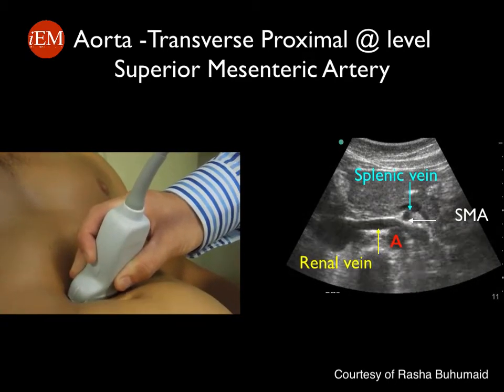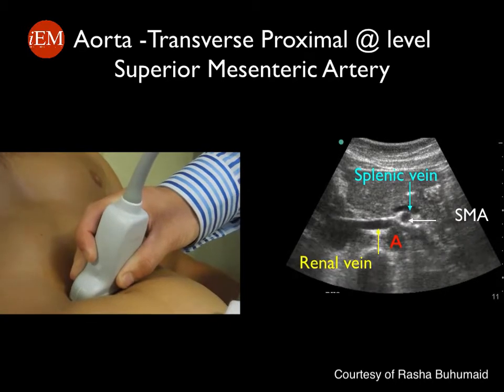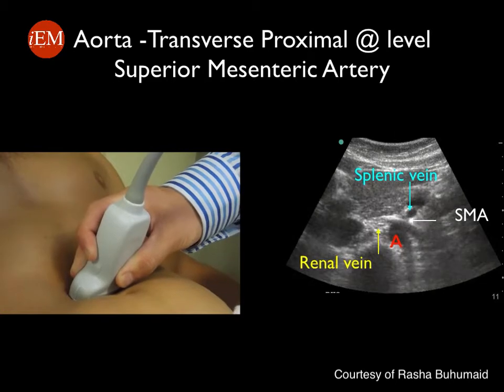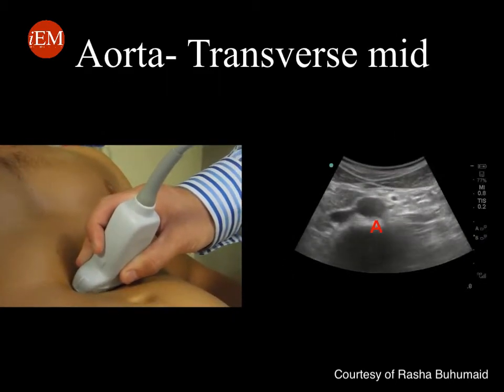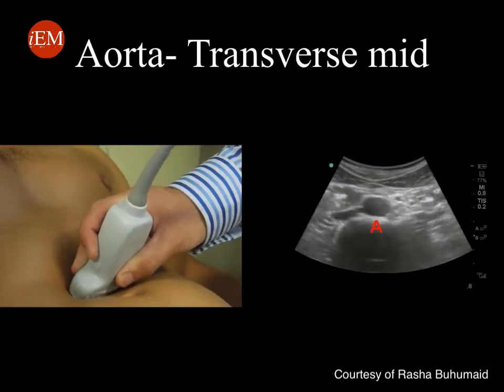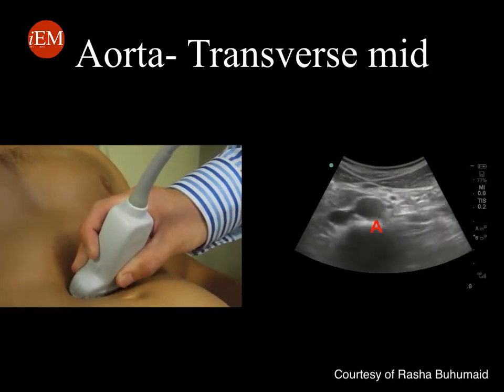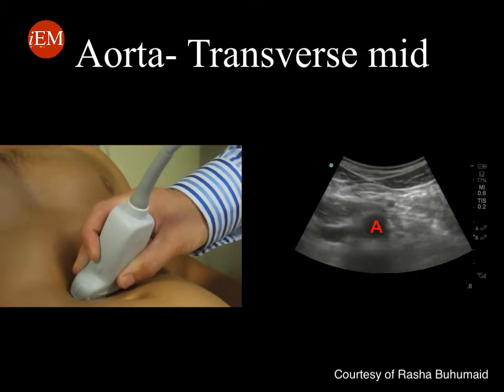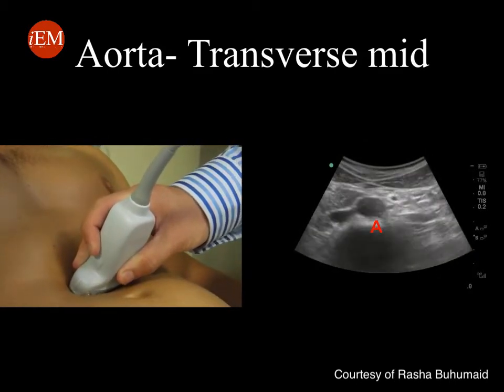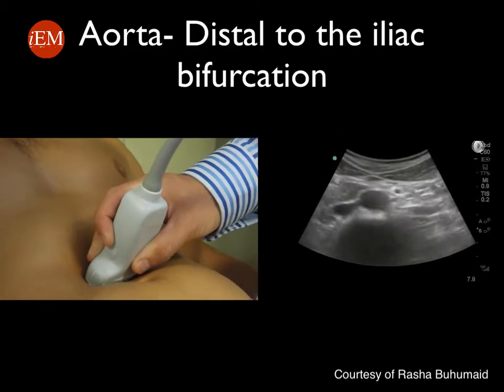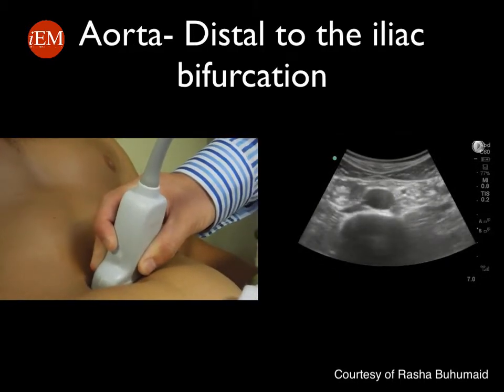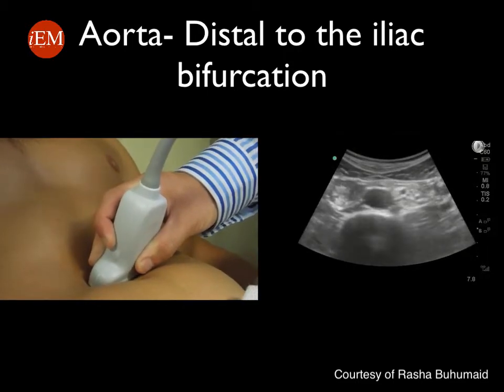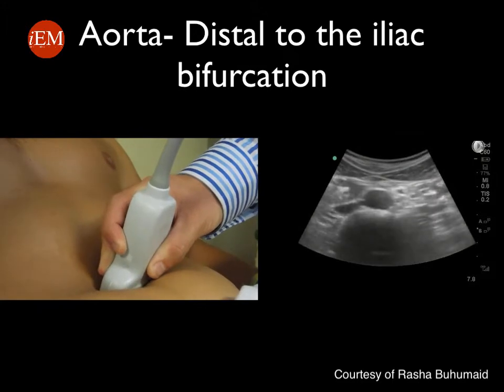Identifying these vessels is not as important as identifying the abdominal aorta and not confusing them with it. Following the aorta more distally towards the umbilicus, the abdominal aorta becomes more superficial with no distinguished vessels visible at this level. Moving more distally, the abdominal aorta then bifurcates into the common iliac arteries, usually at the level of the umbilicus.